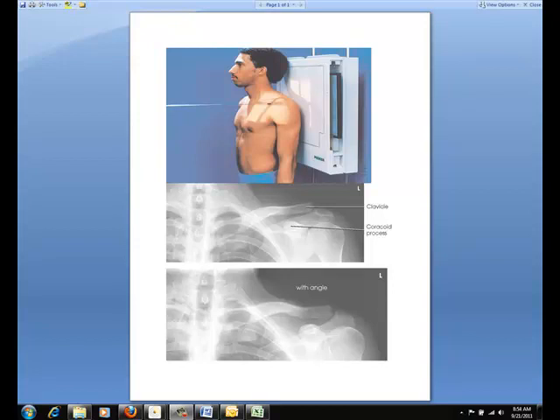The AP projection should produce the following image as seen in the center of your screen. Notice there is evidence of proper collimation. The entire clavicle is centered on the image and there is uniform density on the image as well.